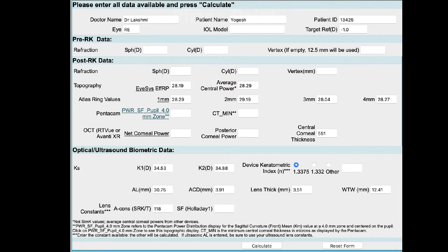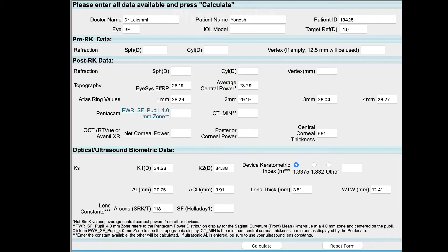The next section deals with refraction in the post-RK period. We are looking for a stable refraction approximately one year after radial keratotomy in an eye with no pre-existing cataract. It is important to remember that very often you do not have a stable refraction one year after radial keratotomy. If you have a fluctuating refraction, it is fine to leave this column unfilled — this data is not mandatory to use the IOL calculator.